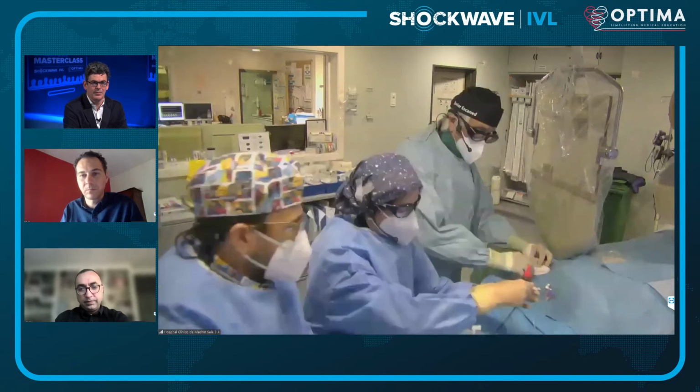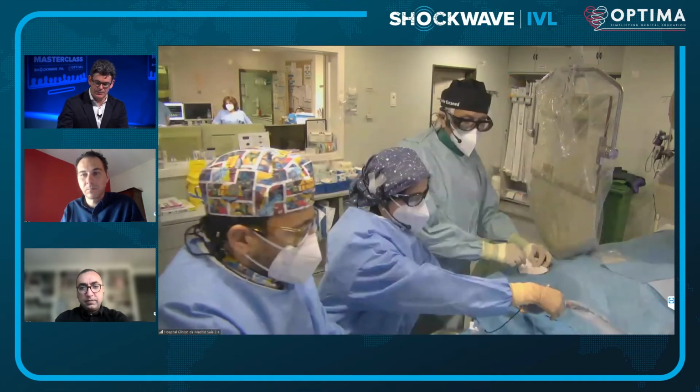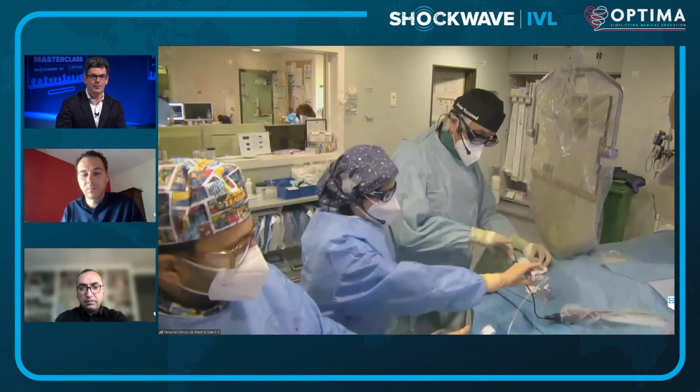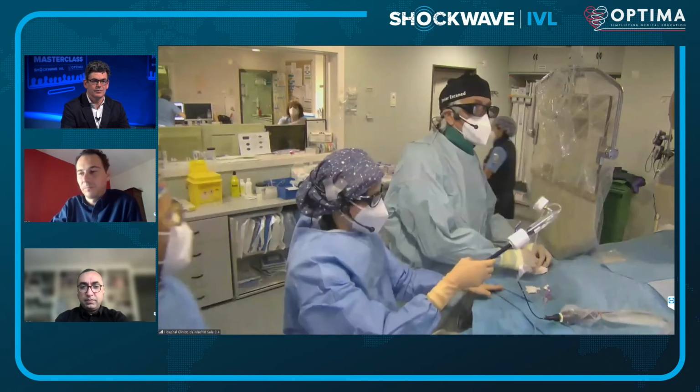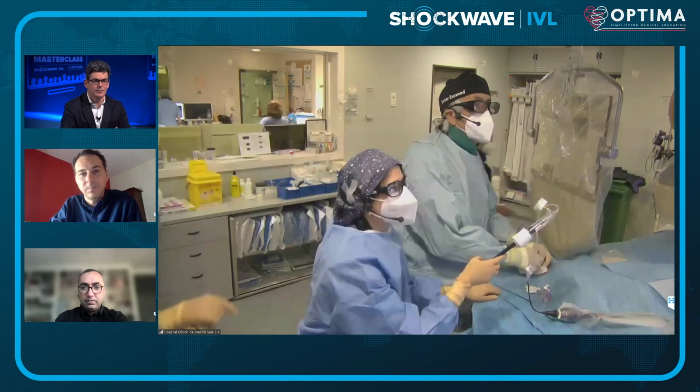Going in the direction of the comment made by Azeem, you could not see dissections or big tears. That would be exactly the opposite if your attitude is using a non-compliant balloon from the beginning. Then you will see huge detachments of the rigid plaque from the soft areas of the vessel, etc. You will see huge dissection.